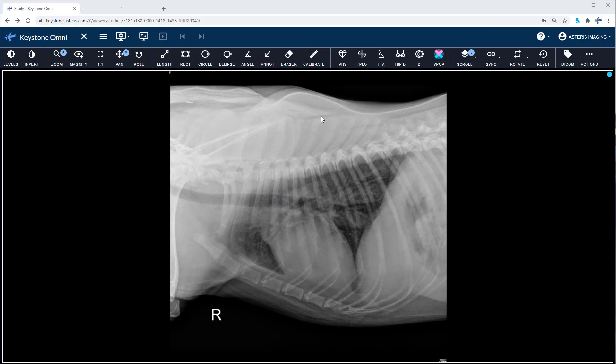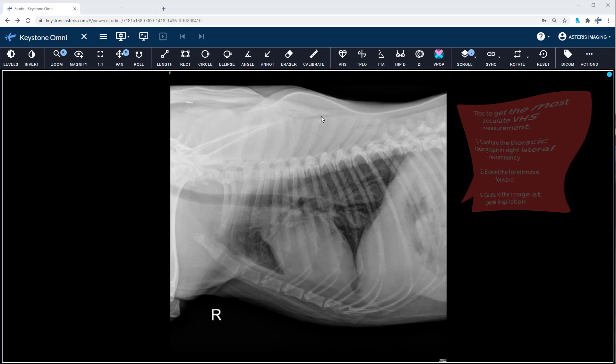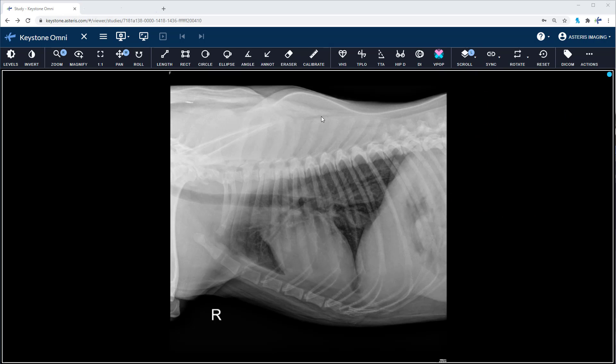Thoracic radiographs often provide the first glimpse of cardiac structures in dogs and cats being evaluated for potential heart disease. Assessment of vertebral heart score can provide a subjective and objective value to heart size based on the patient's own thoracic vertebrae. The Keystone Viewing Suite includes an integrated vertebral heart score tool.